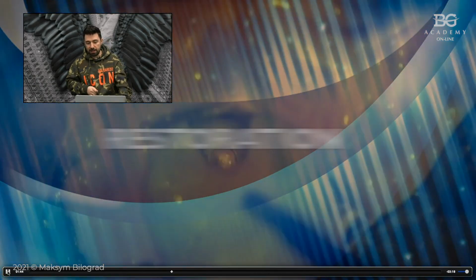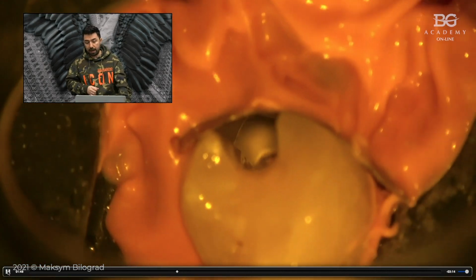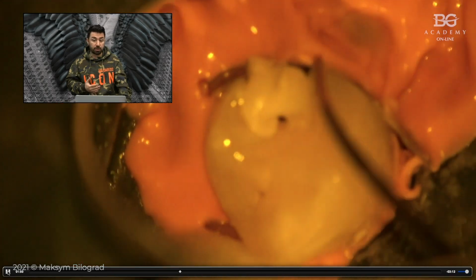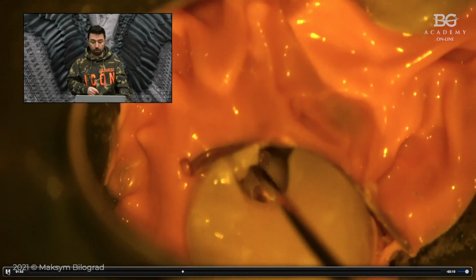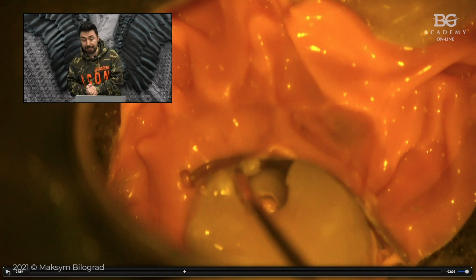Another problem is about pulp horns, and now I'm going to share with you tips and tricks related to that issue also. Regarding restoration, look what I did. Since we don't have the possibility to use packable composite alone, we decided to do a combined way of restoration. We used a highly filled flowable.